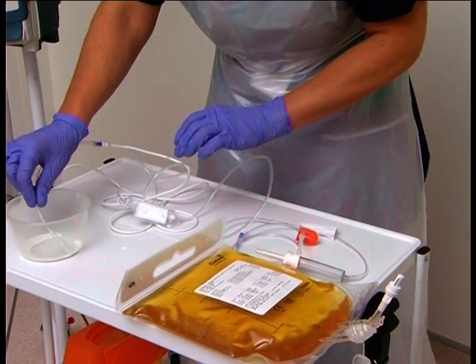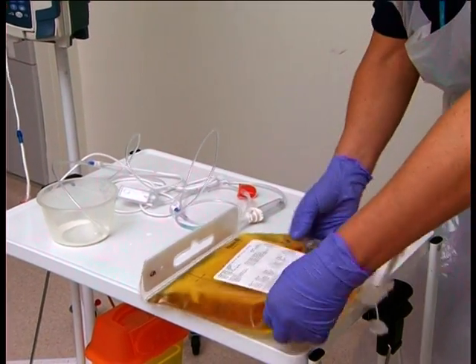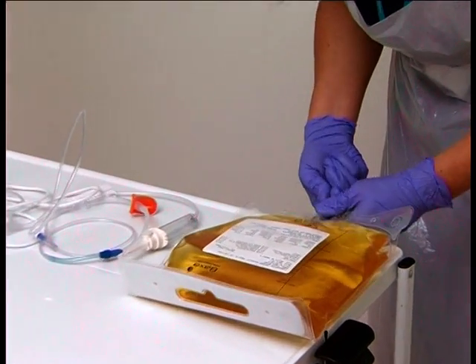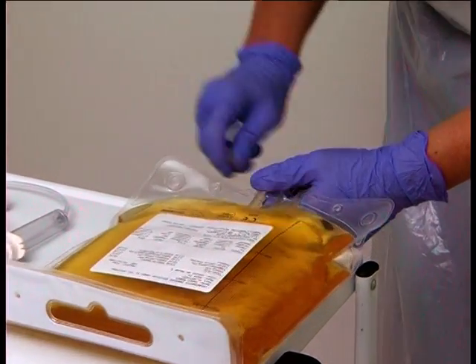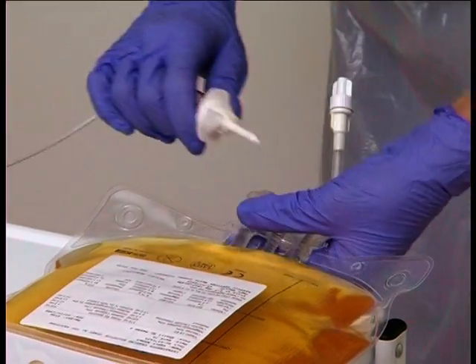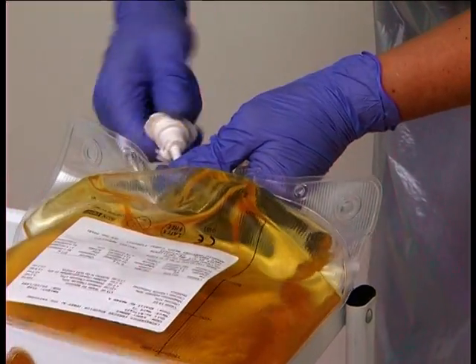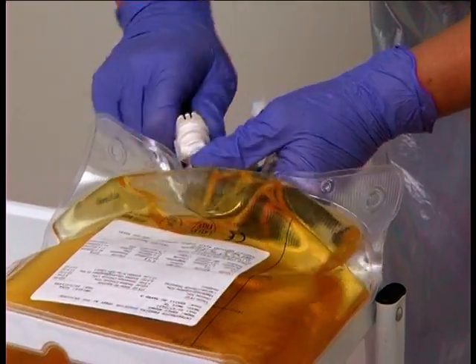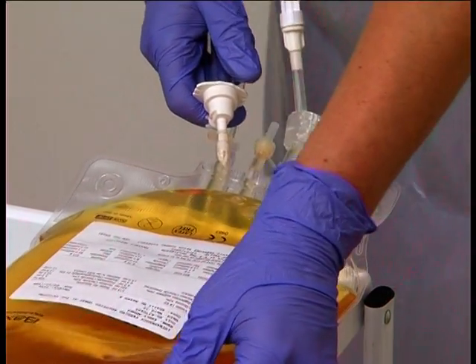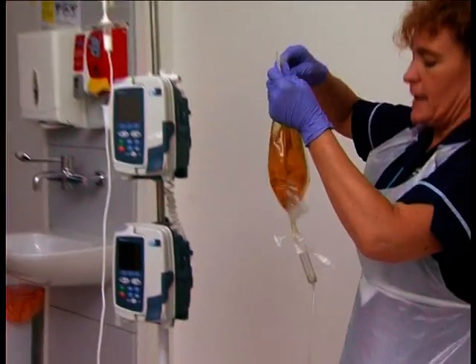Place the end of the filter giving set into the bowl. Remove the cap from the connection port on the aqueous infusion bag, taking care not to touch the key part. Using a two-hand technique, remove the cover from the giving set spike. Join the giving set into the infusion bag, taking care not to touch the key parts or twist the giving set. Hang the bag on the infusion stand.